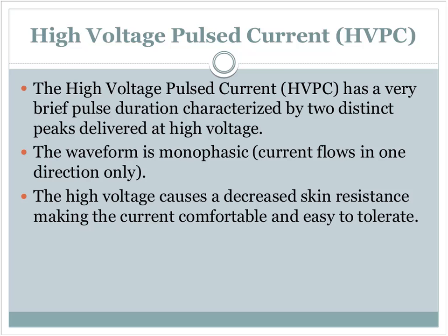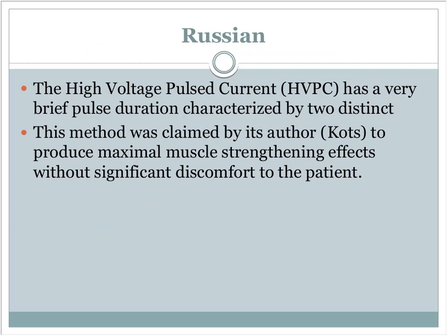We'll put the negative over the wound for the first week on a daily treatment. And then after that, we'll switch between negative and positive about every 3 days. So 3 days of positive, 3 days of negative, back and forth until the wound has healed. So that's the high volt pulse current.